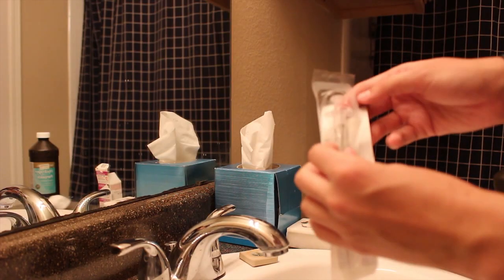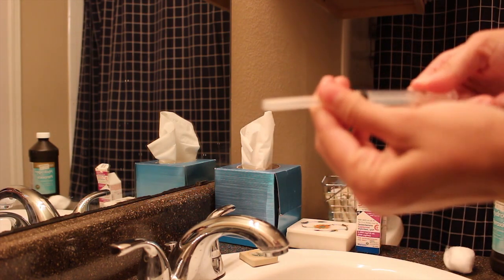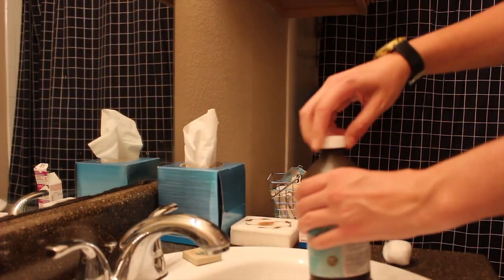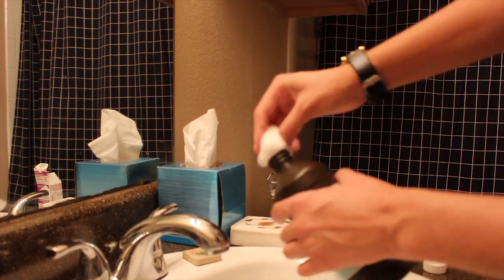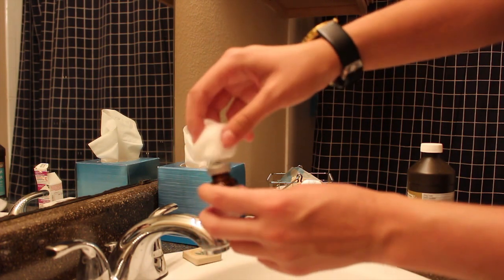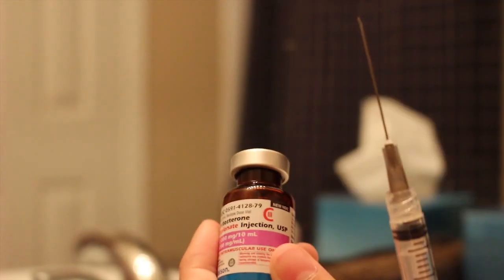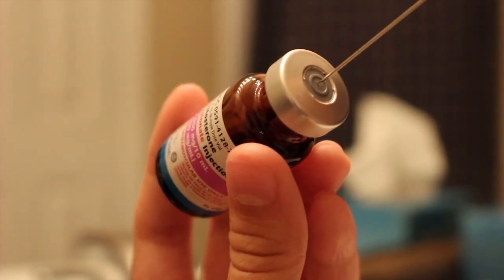Now I'll show you what I do when I do the injections. First, I make sure that the syringe is out of the packaging and I place that aside. Then I also take my band-aid out and have that ready. Next, I take my hydrogen peroxide and put it on my cotton ball, then wipe the top of my vial with the cotton ball. Next, I take the cap off my syringe and push the needle through the top of the vial so I can start getting the testosterone out.